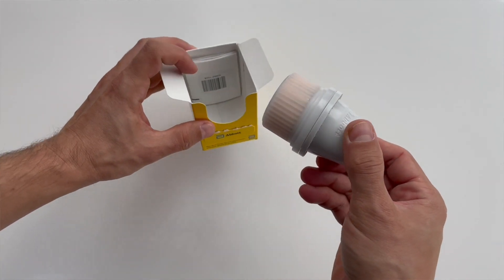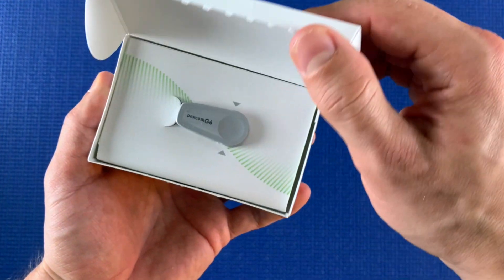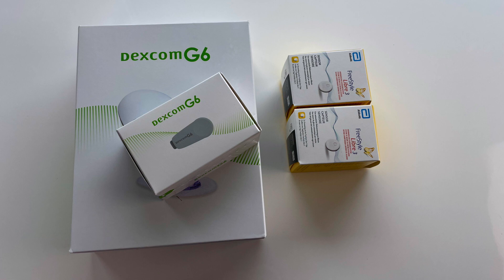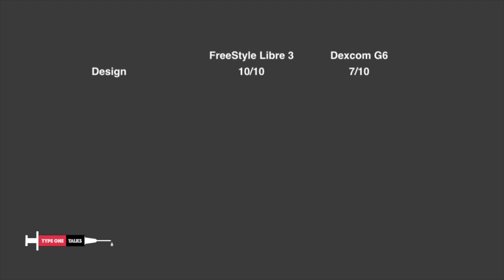And speaking of sizes, for me it's not only about the sensor size. It's also about the size of the packaging and the amount of plastic waste. Here is a comparison of one month supplies. You can see that the amount of waste from Dexcom G6 packaging is of a different order of magnitude. So when it comes to design, Libre 3 wins by a lot for me and gets 10 out of 10. Dexcom G6 only gets 7 out of 10.